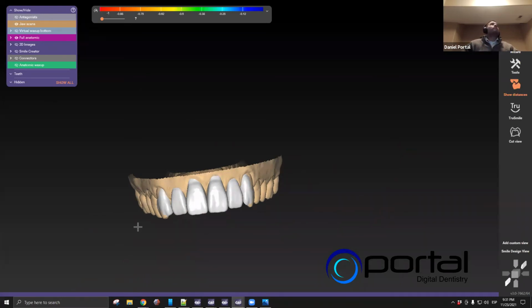Now, again, quick question here, sorry. When we share Dental Share, will the dentist get to just view or edit as well? No, just view, it's just a viewer. So that's a really good question. Otherwise, I guess exocad will just be creating a free CAD software people can access online and edit. So as of now, whether that functionality will be added later or not, I don't know. But as of now, it's just a visualization tool.